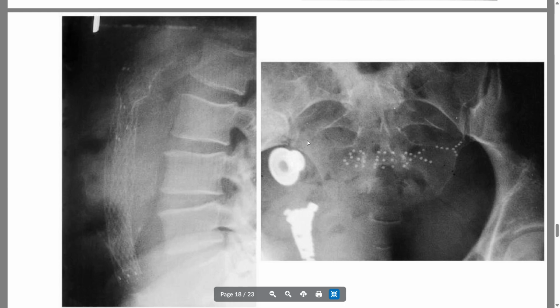I have only seen this once when I've taken an x-ray. Usually patients are a little bit more conscientious of this when you ask them about anything that they could be wearing that has metal on it, although sometimes they just forget that they have that in.